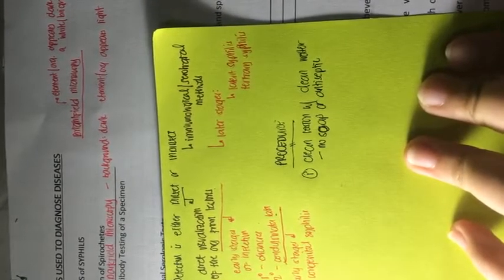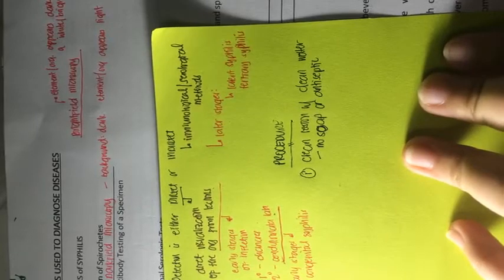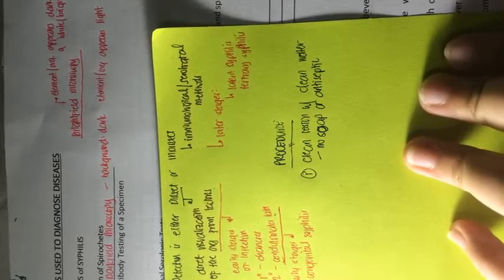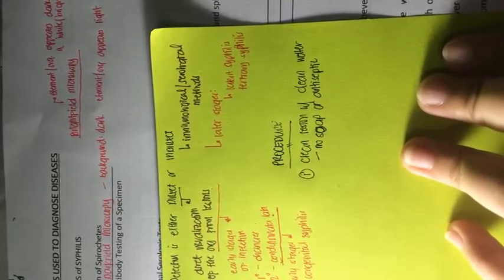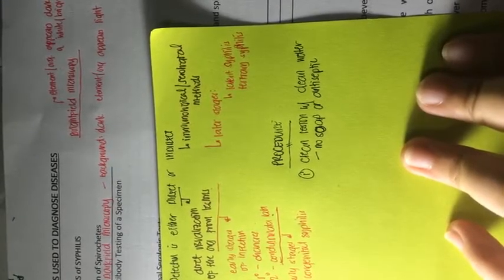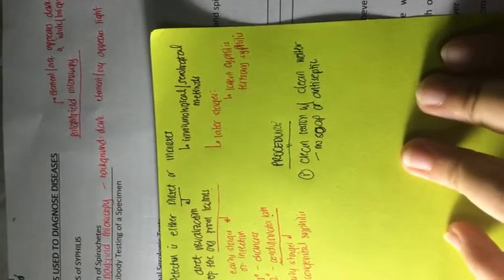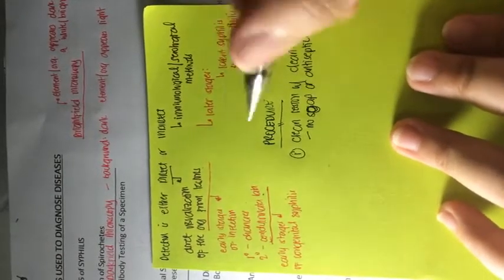So even in, for example, regular Gram stain or regular KOH, when we do KOH, we scrape the skin. Upon scraping, we usually ask our patient if they have taken a bath. You can really feel the surface of the skin if a lotion has been applied prior to sample collection. So if a lotion is applied, we should always ask our patients to clean the area to get rid of the lotion that has been applied on the surface of the skin. And again, soap or antiseptic should not be involved in the cleaning of the skin surface.